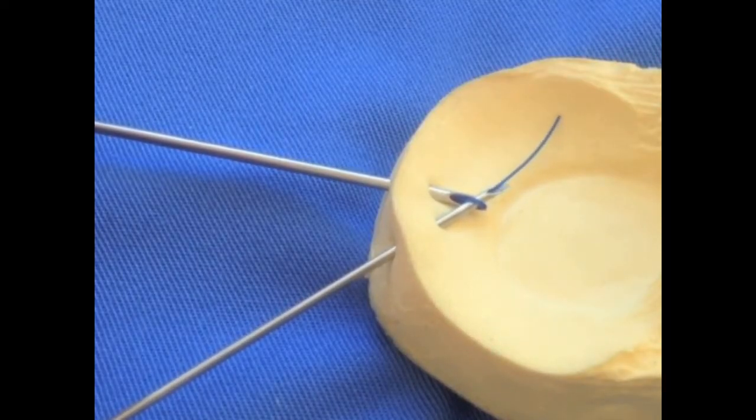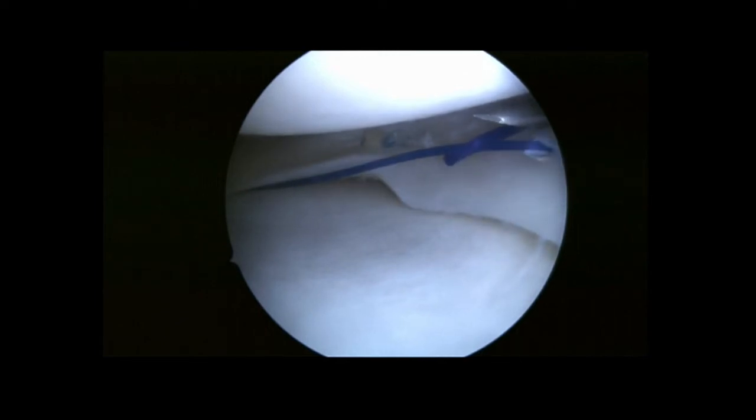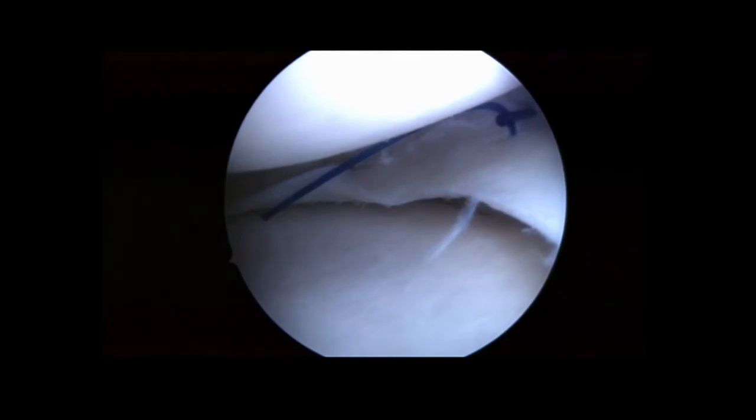When this last step has been achieved, unloading the single suture needle and simultaneously extracting the needle, followed by pulling of the lasso loop, will retrieve extra-articularly the single suture.